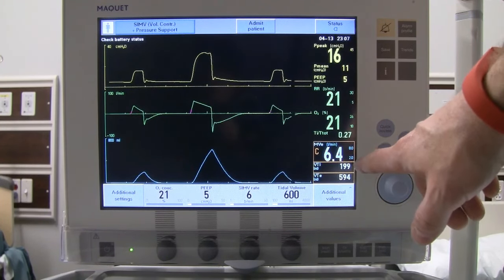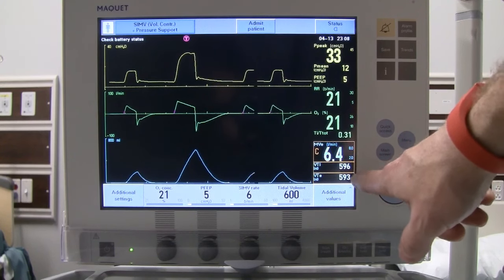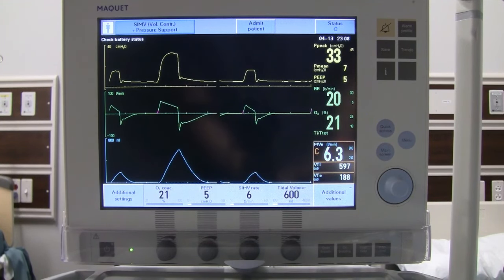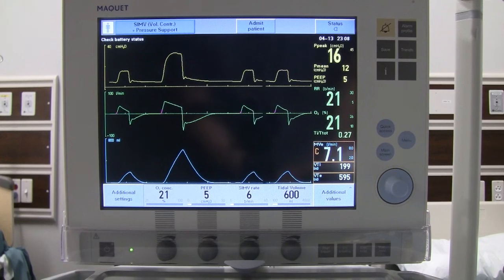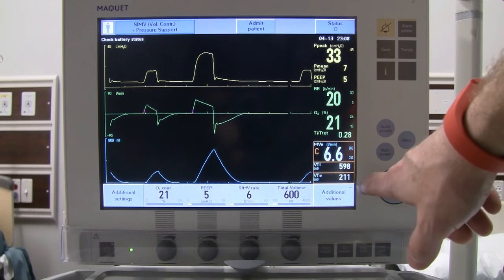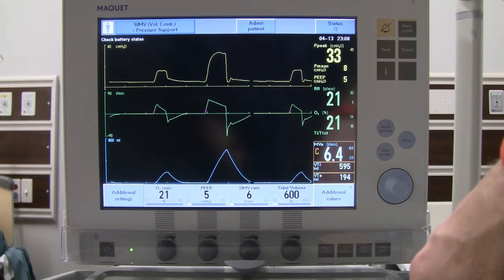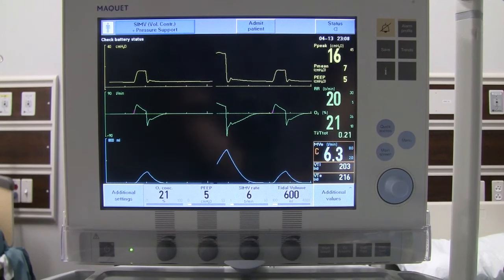For tidal volumes, expiratory tidal volume is generally more important than inspiratory. Watch your waveform — after an assisted breath, wait for the reading: 593 mL is our mandatory exhaled volume. Then wait for a spontaneous breath and note the expiratory reading for that breath — 216 mL is our spontaneous volume. We can also use the additional values screen to access peak pressures and other documentation data.